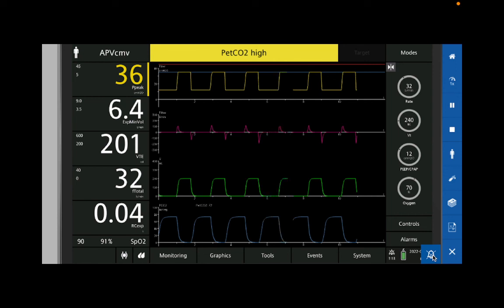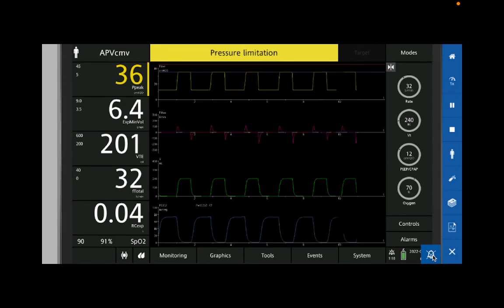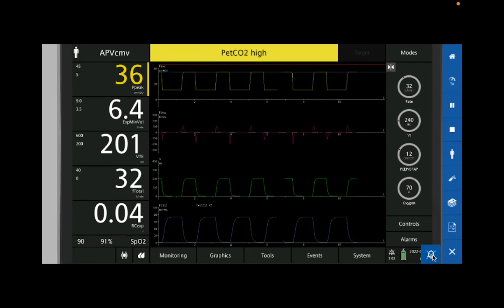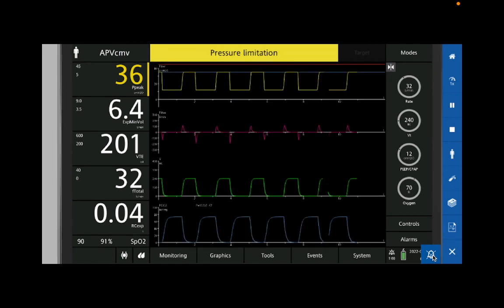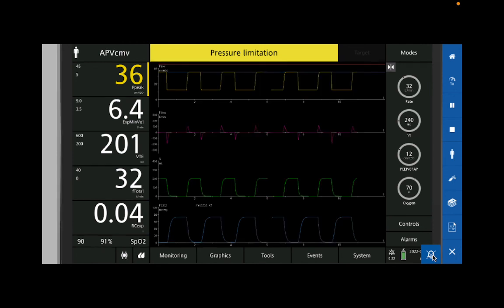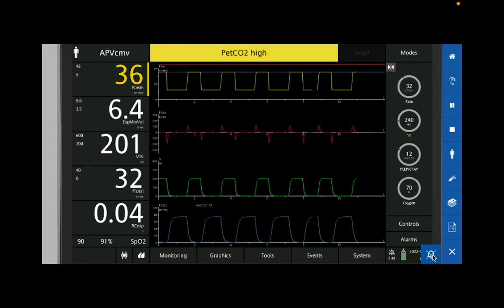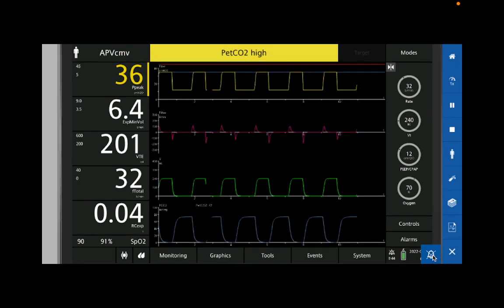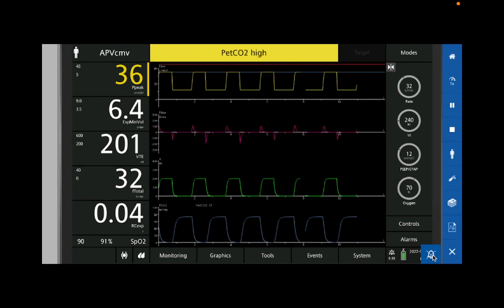For 2 reasons. If you leave the patient on a FiO2 of 100, what are the nurses going to do next time the patient desats? Call you. If you leave them on an FiO2 of 70, what are they going to do next time the patient desats? Increase the oxygen. Which one lets you finish your case or finish your notes or sleep? So walking away from a patient whose FiO2 is 100 doesn't leave you in a good position to go sleep. So you want to optimize them before you go. Increase their PEEP. Does PEEP improve sats slowly or quickly?